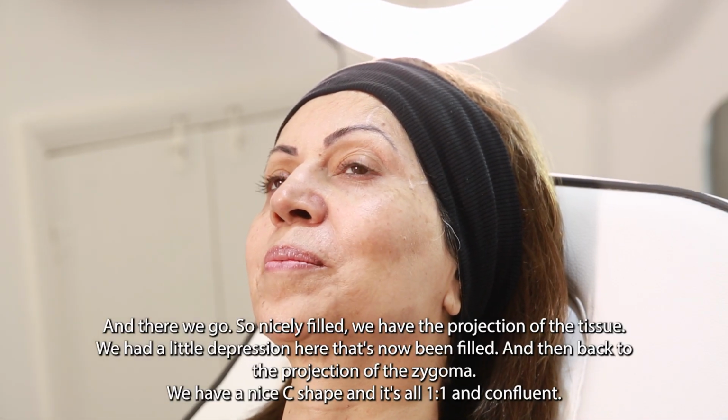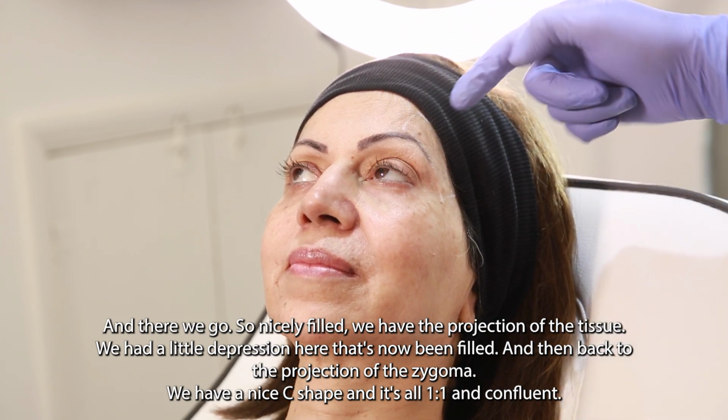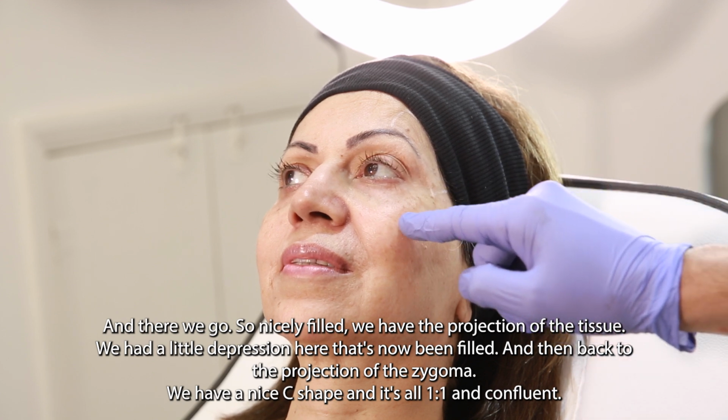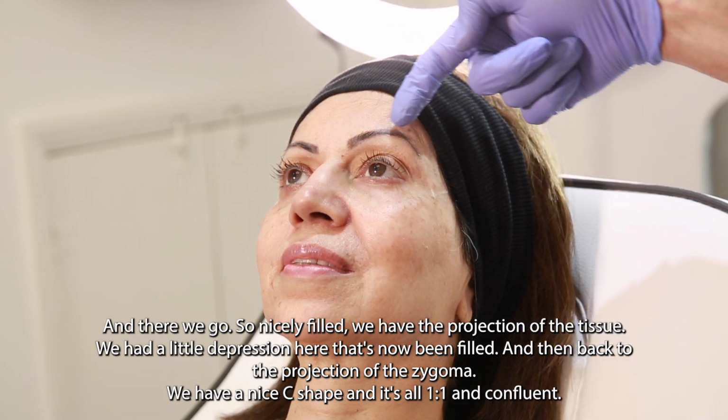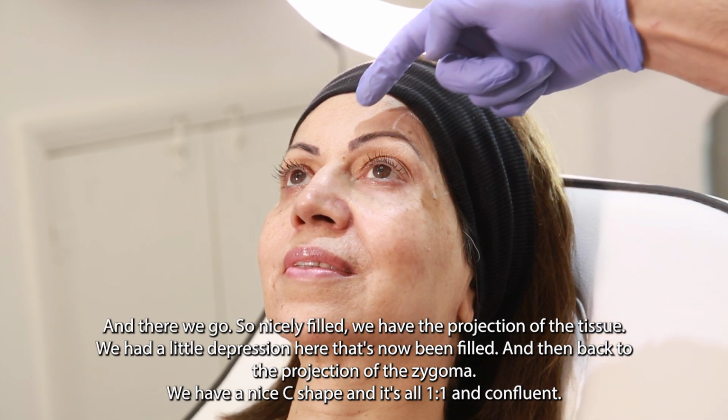And there we go. So nicely filled. We have the projection of the tissue. We had a little depression here that's now been filled, and then back to the projection of the zygoma. So we have a nice C shape, and it's all one-to-one and confluent.